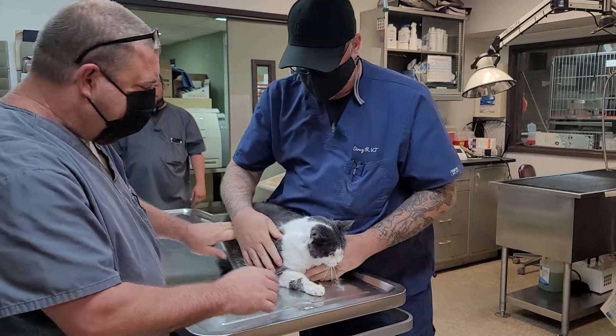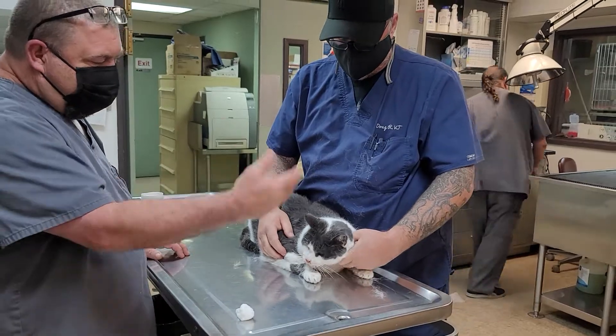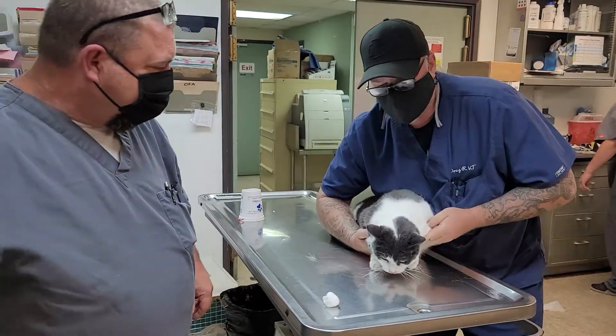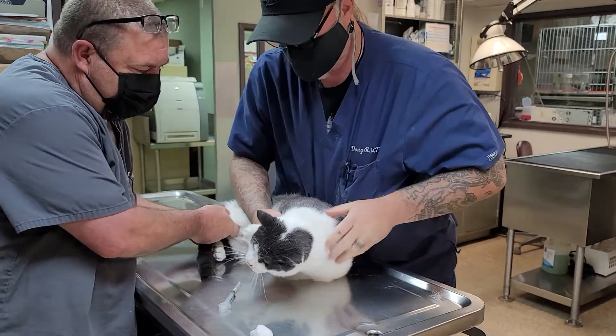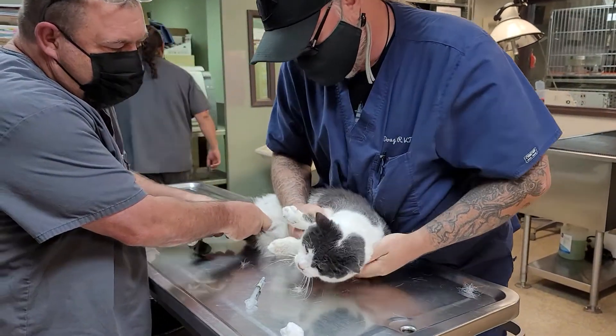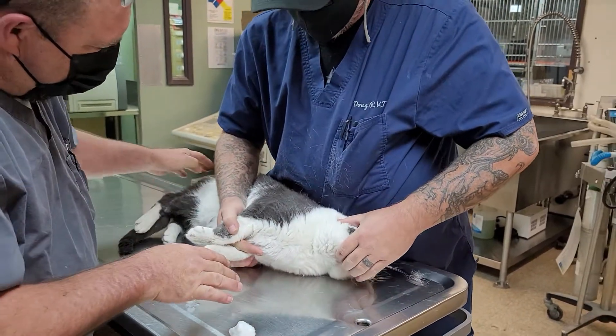They just don't like it. A better way is to lay them laterally, very gently. He's not going to grab the head — he's just going to put his hand like that.